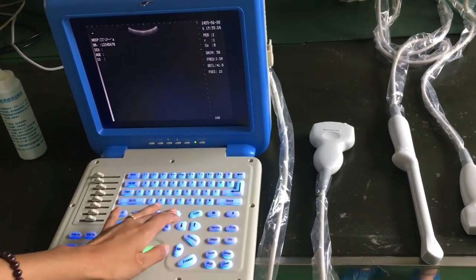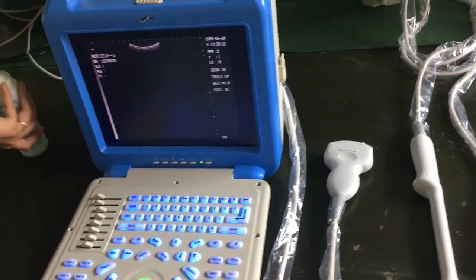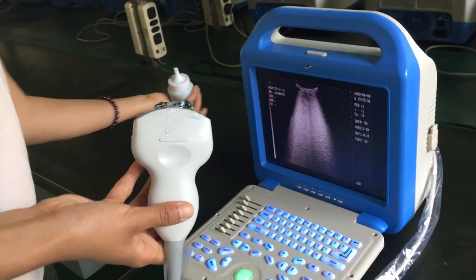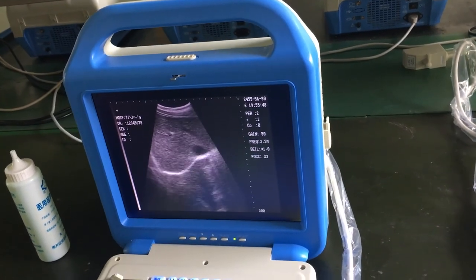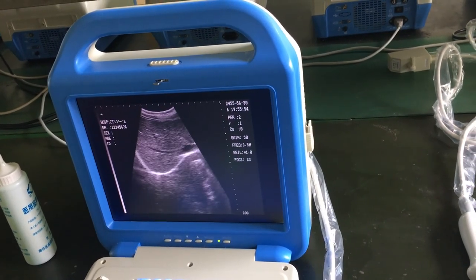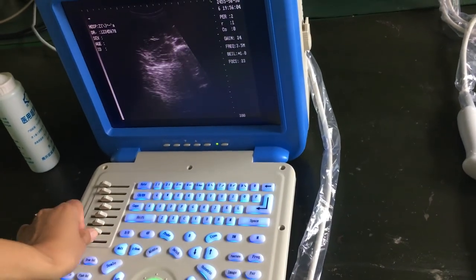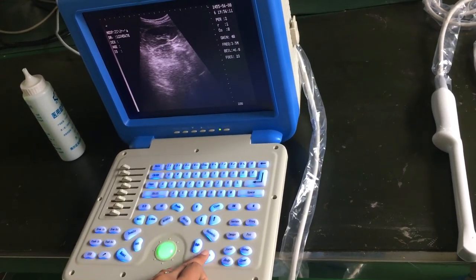Let me go back to B mode and freeze the machine. This is the image — let me show you the image quality. This is my liver and kidney. If you think the image quality is not good, you can adjust the TGC to improve it.